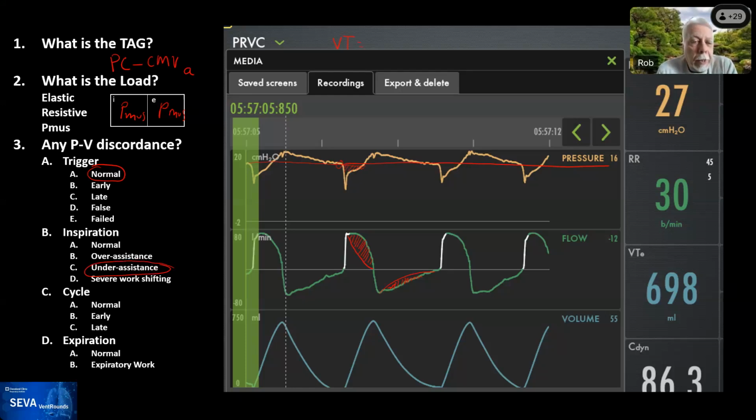I mean, you could argue she's breathing 30 and it's pulling 700 cc's. But assuming this was, I mean, with a PEEP of 16 and actually the FiO2 was 60%, many of us would feel pretty uncomfortable with letting this patient breathe throughout. But the question that I would get is, how do we measure the amount of effort this patient is doing?